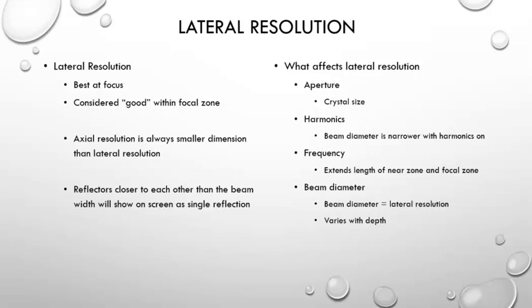Anything closer together than the beam width shows up as one reflection, which means we can't resolve it. We can't tell that it's actually 2 structures. Things that affect lateral resolution: the aperture of the crystal, which is another way of saying the crystal diameter or the crystal size.